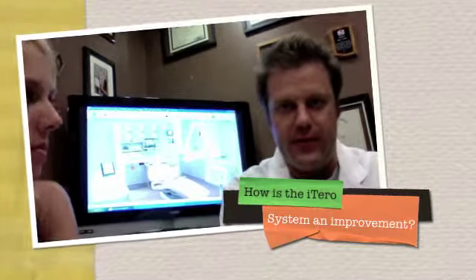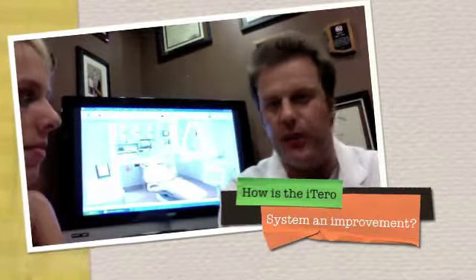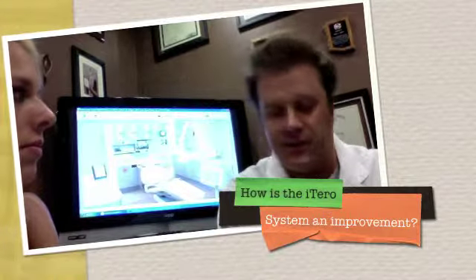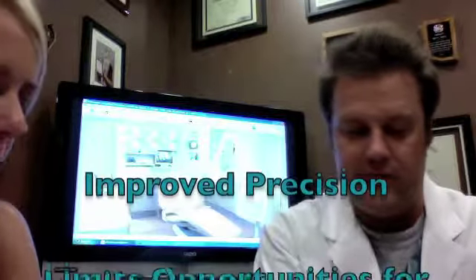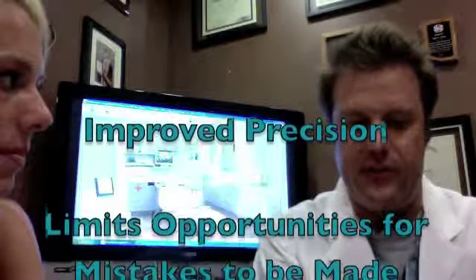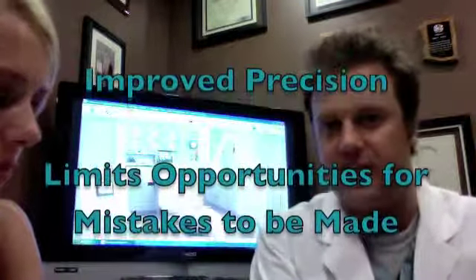When you make restorations out of a model, when you put impressions in their mouth, there's multiple steps where there can be distortion in the material that we take the impression with. In pouring up stone, there can be different variables, expansion, contraction of plaster and stone. Depending on if it's a humid day, there can be more moisture in it, and so things fit better having a computer mill a model out of something that's fixed.